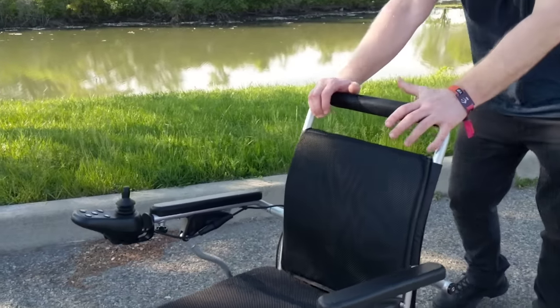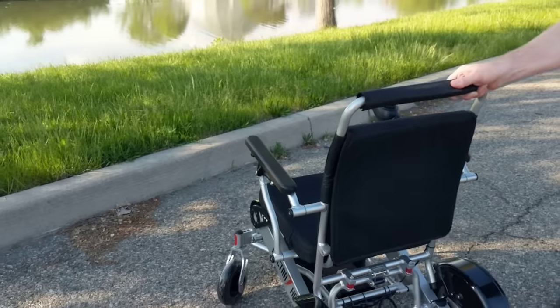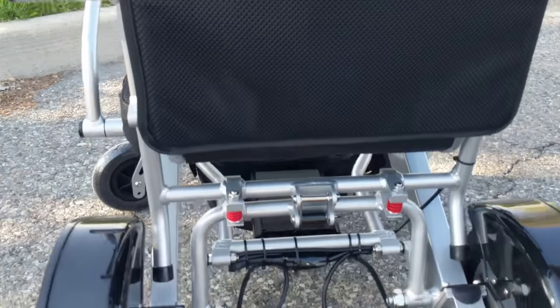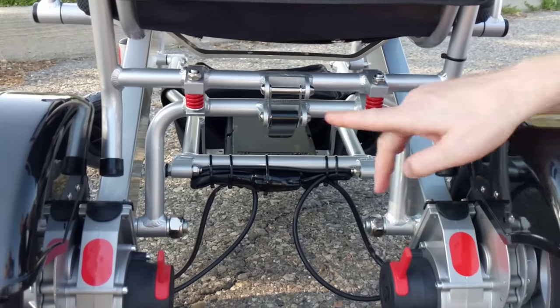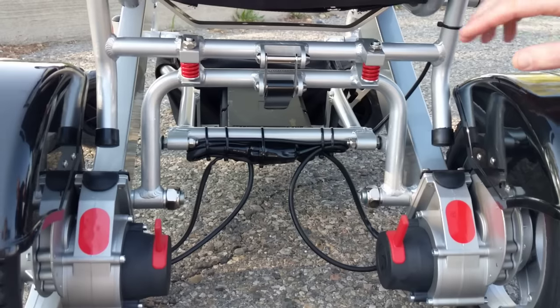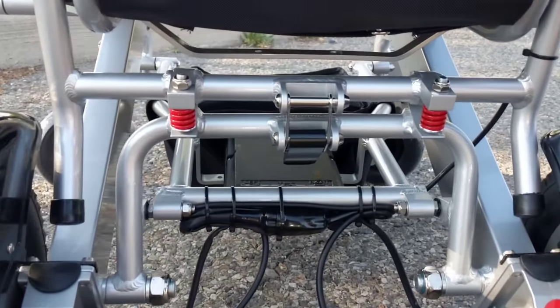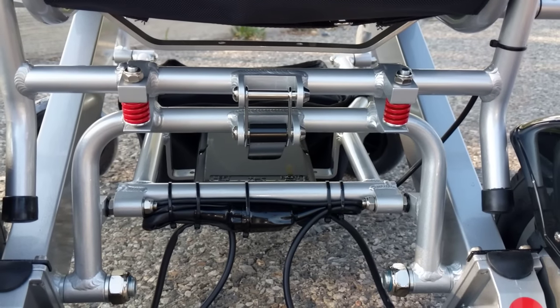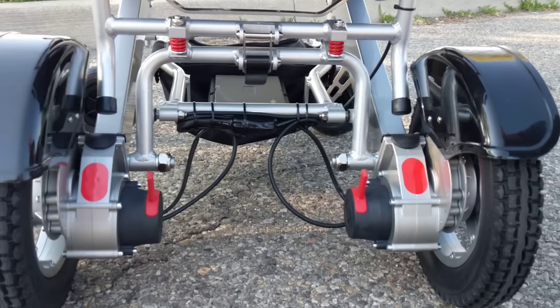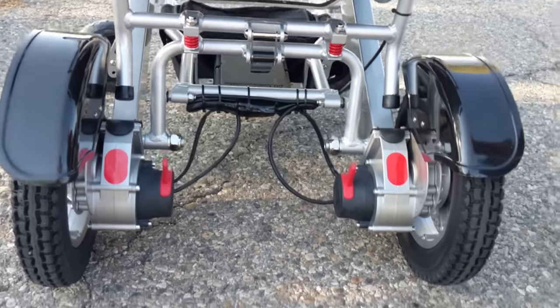So moving on, let's take a look at some of the components in the back of the chair here. You can see we have the Dura Shock system. This particular chair, with the Dura Shock system, is designed to absorb energy and impact from the surface. You can see where we would be driving — a nice rocky area or concrete — no problem at all with the Dura Shock system.